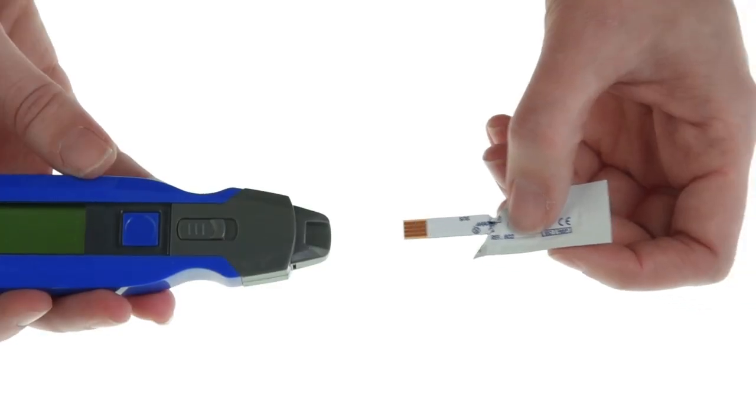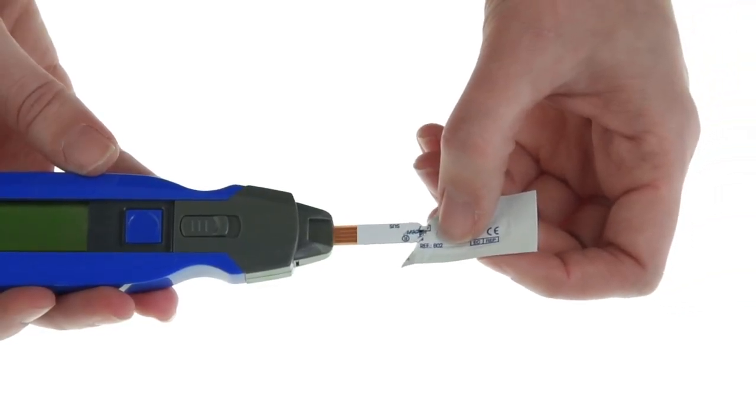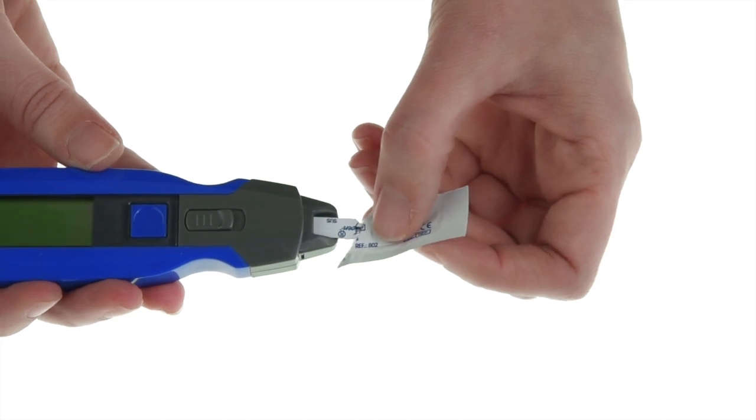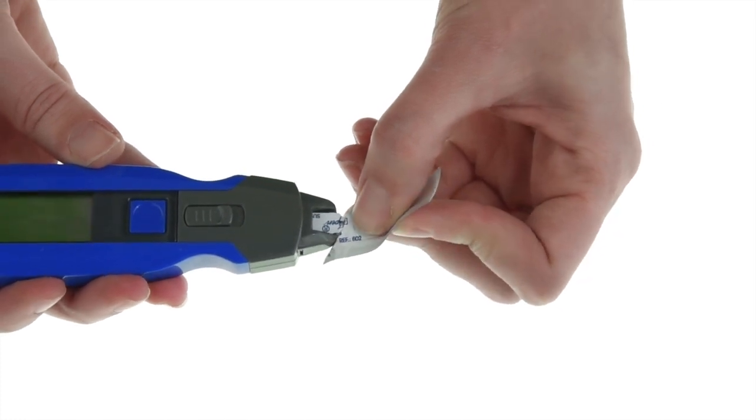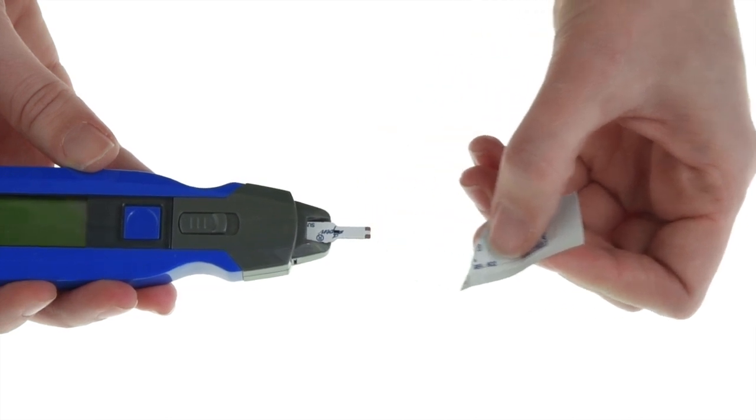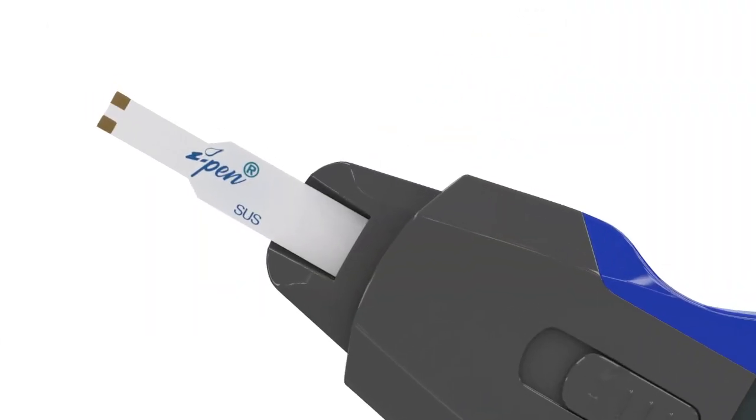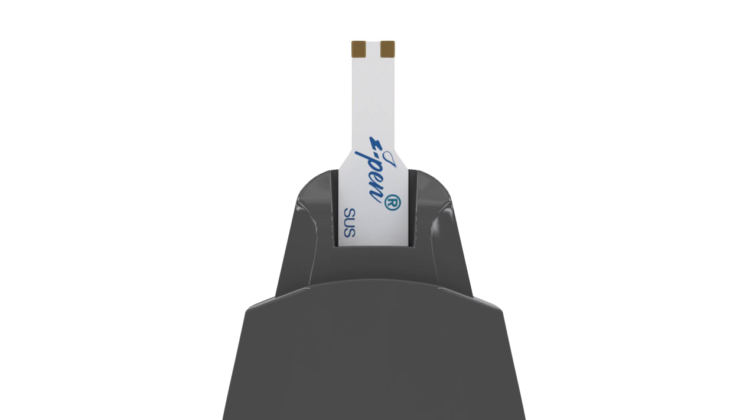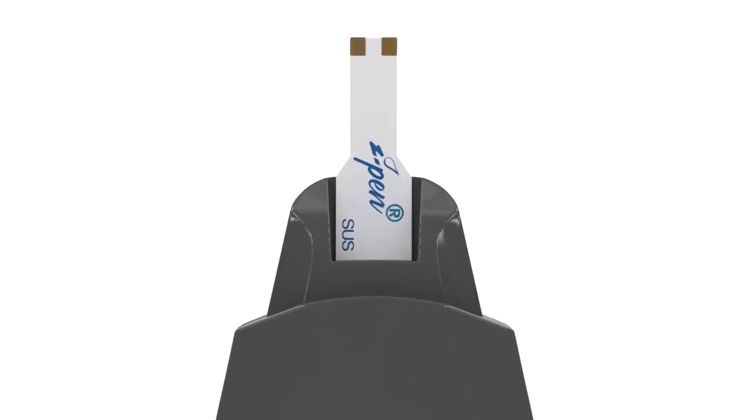While holding the single-use sensor by the unopened package, securely load the iPen by inserting the thicker end of the sensor firmly into the opening of the iPen. The sensor will function with the writing up or down. Take note to fully insert the sensor so that its shoulders line up correctly with the device. This ensures proper internal contact for all the electrodes.